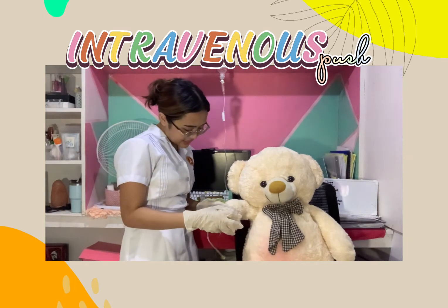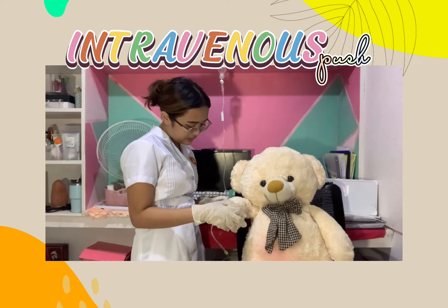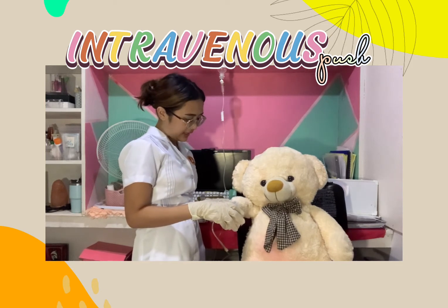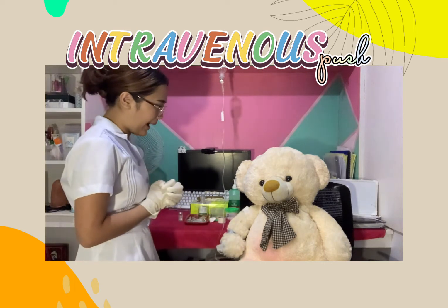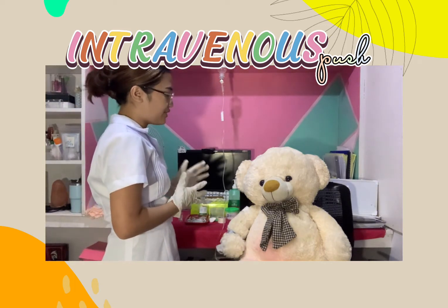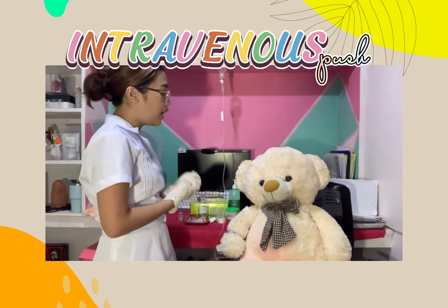It states here po that your name is Ayana Naku, bed number 1, sex female, date of birth po is June 9, 1998. Is that true po, ma'am? Okay po. Ma'am, we are going to perform the IV administration po using the IV push po for the ordered medication.